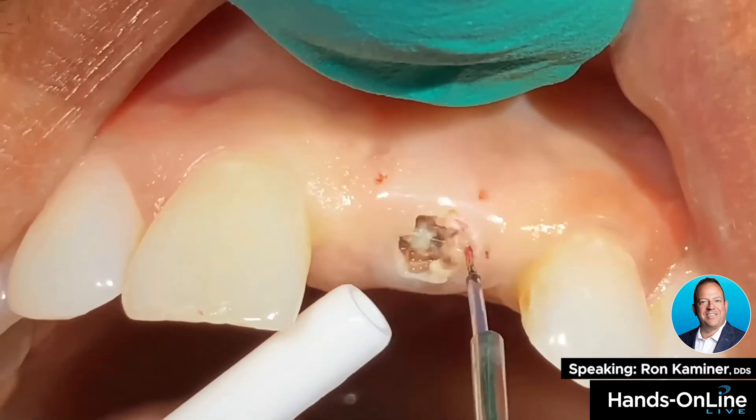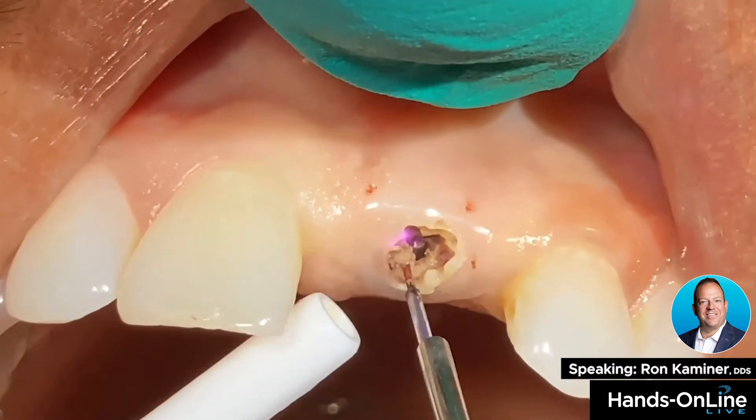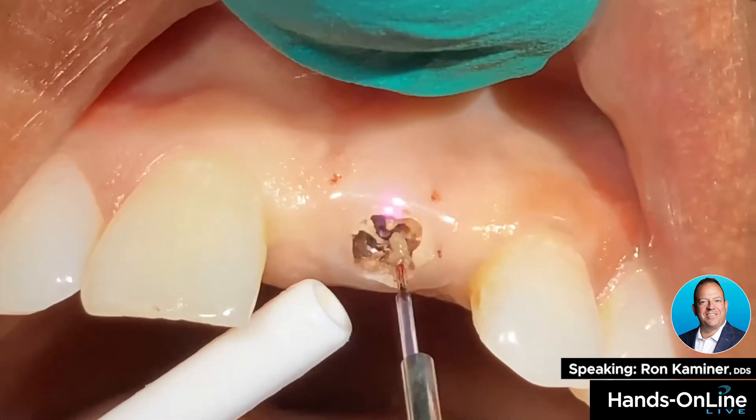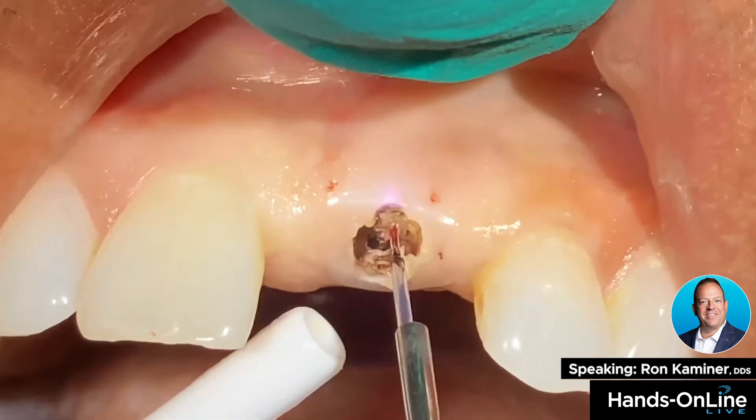I'm literally on the head of the implant — you can see there's no sparking or arcing. We have the blue wave here set to 1.1 watt with an initiated tip.